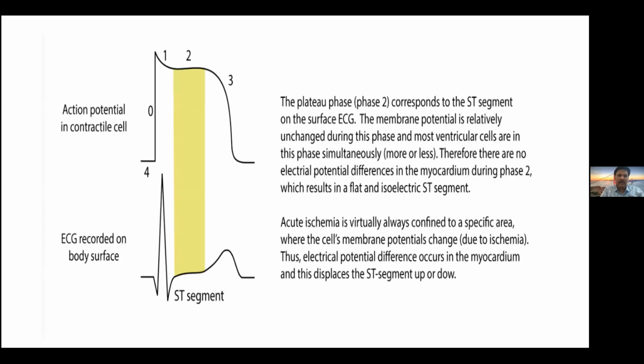This is the ST segment which normally we see. It is the corresponding phase of the action potential in the cardiomyocyte, and the same thing will be seen in the ECG as the ST segment.